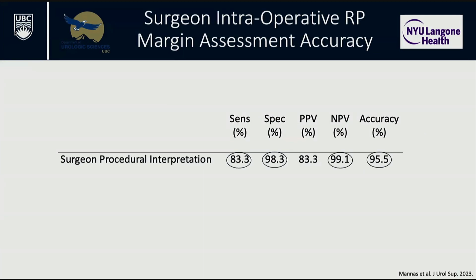Yeah, you know what? Right now, I don't have the AI for this. I did test the AI after. The AI was only trained on biopsies. Now, I have 121 margins. And if you think of a biopsy, it's what, 1-ish millimeter by 2 centimeters. These margins are like 5 millimeters by 5 millimeters. So there's a ton of data in it. I've just finished annotating them for training. So I'm going to be assessing how well it performs retrospectively and then hopefully prospectively. For now, I've looked at a bunch of these and I kind of know what I'm looking for. It does take some training, but in the end, the goal would be for AI to do it in real time.